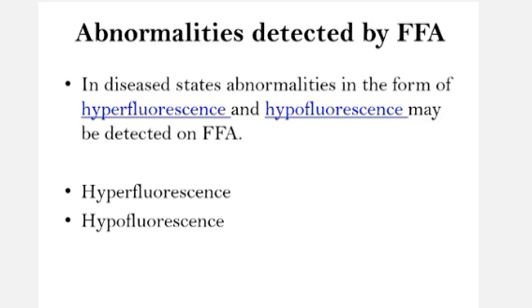In disease states, abnormalities in the form of hyperfluorescence and hypofluorescence may be detected on FFA. So we are seeing in detail what hyperfluorescence and hypofluorescence are.